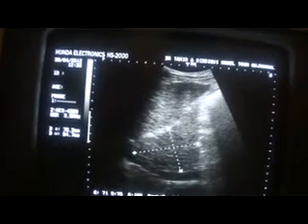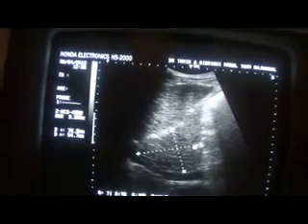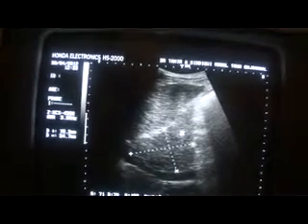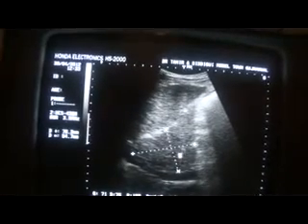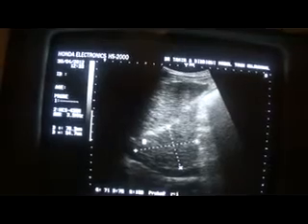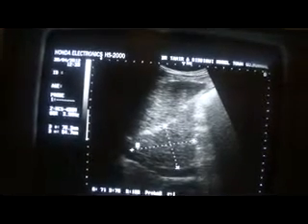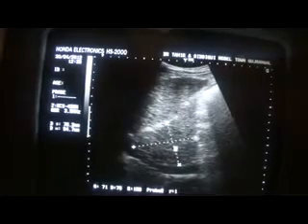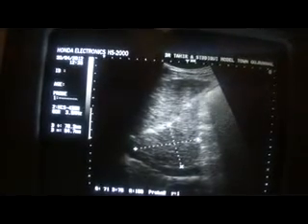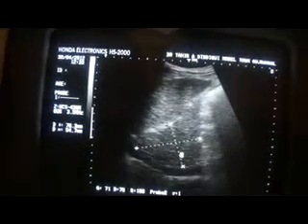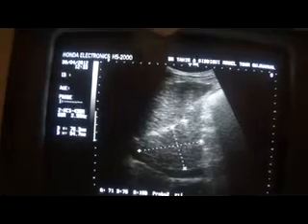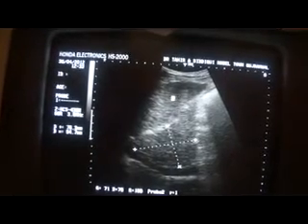This is the transverse view of the left lobe of the liver. This is the ligamentum venosum. This is the inferior vena cava in transverse section. This is the caudate lobe of the liver, and this area again is showing hyperplasia.